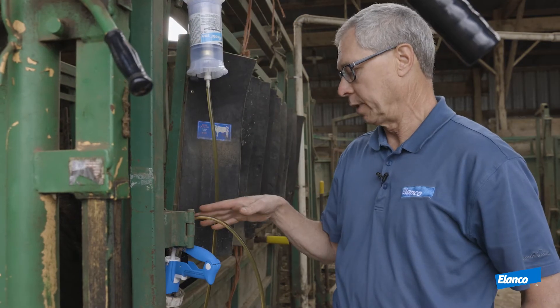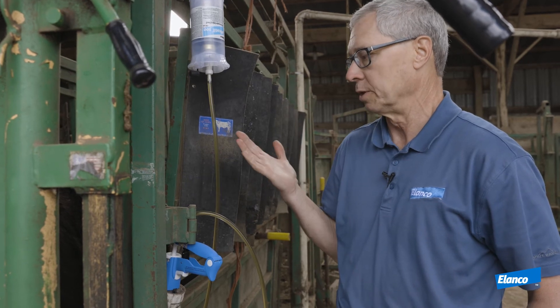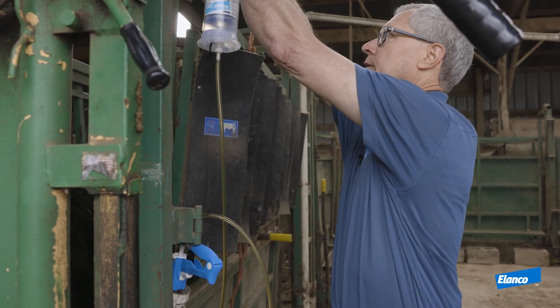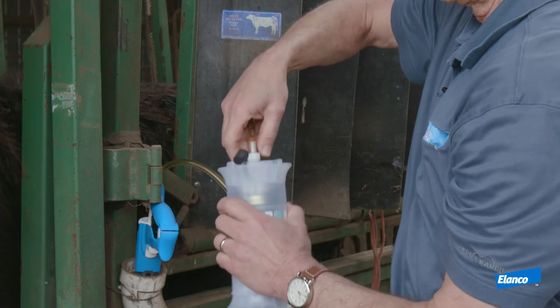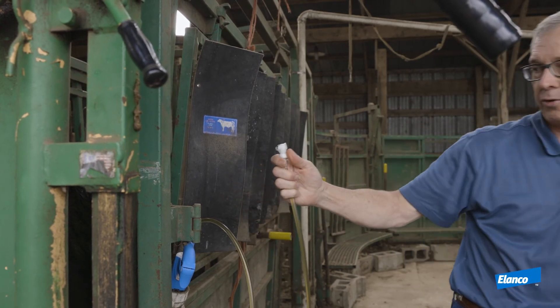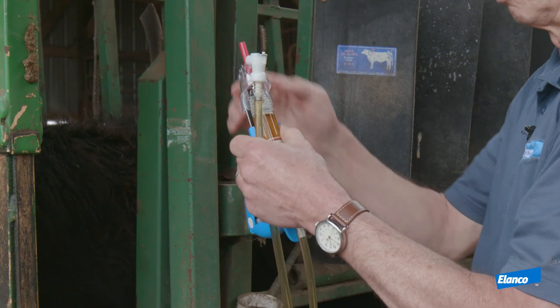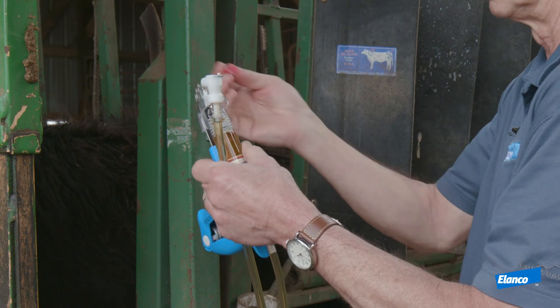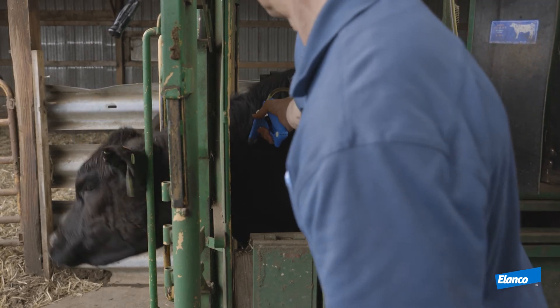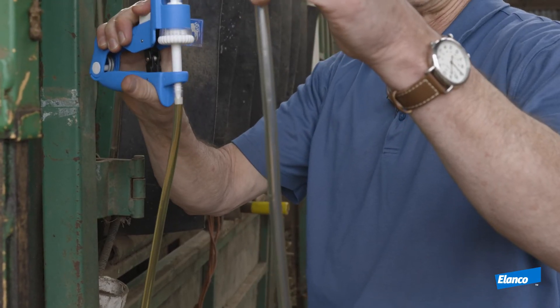For storage of the Mycotill bottle, syringe, and hose, we want to have the hose and the syringe empty when we're finished. So with about five calves left to process, I'm going to take this down and remove the quick connect coupler from the bottle, set the bottle back over on the shelf, and then inject the next calves so that my syringe and my tube are all empty when we're done — that way I can clean the syringe. I'm going to remove the needle cap, depress the trigger, put it against her skin, and inject this animal so the Mycotill is emptying out of the hose.